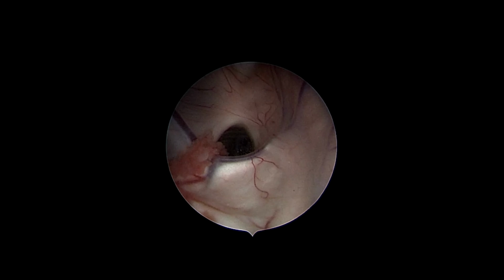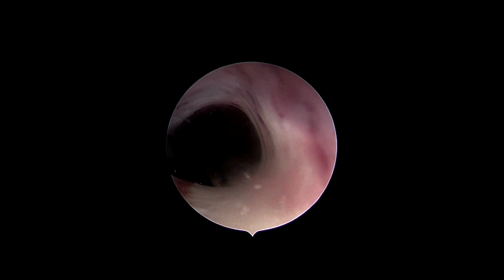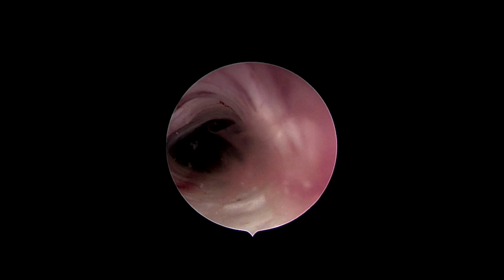Finally, getting back and checking for any injuries to the fornix or thalamic vein or any bleeding.